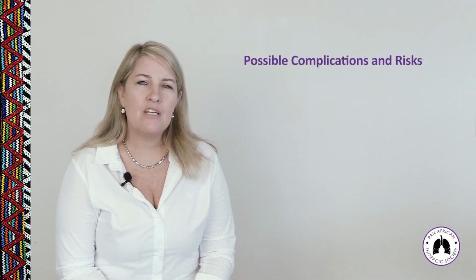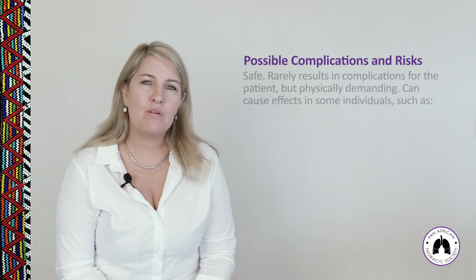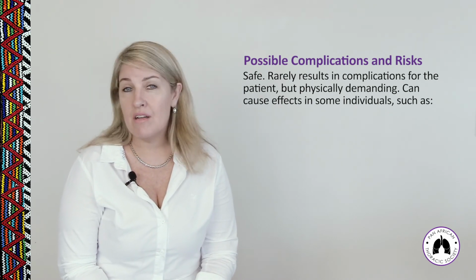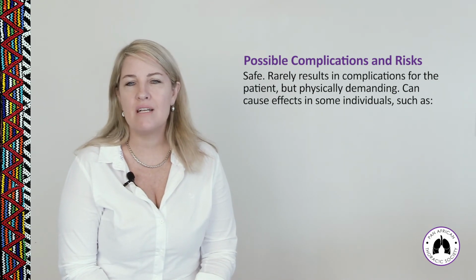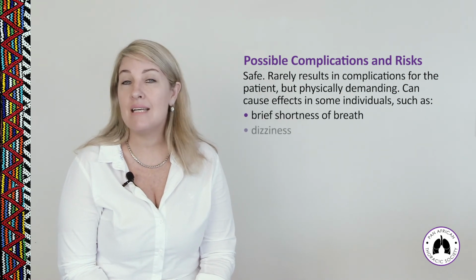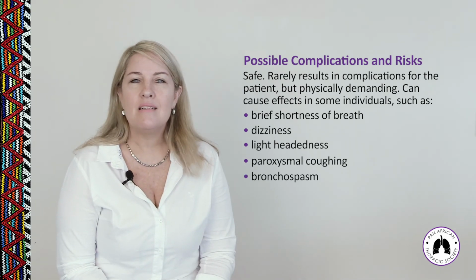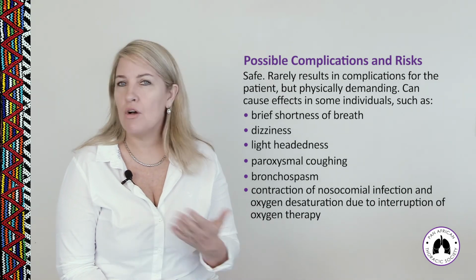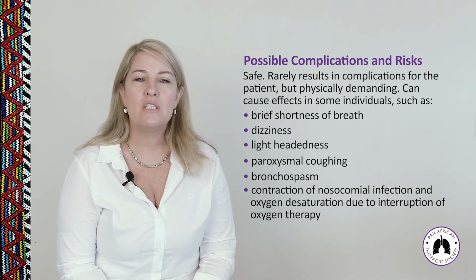Thinking about the complications and risks to spirometry in children, spirometry is generally a very safe procedure, and it rarely results in any complications for the patient. However, it can be physically demanding, and for this reason, occasionally can cause effects in some individuals, such as brief shortness of breath, dizziness, lightheadedness, coughing fits, bronchospasm, and occasionally, looking at infection control, you could possibly pass infection on through a spirometer, although the risk of that is very, very small.